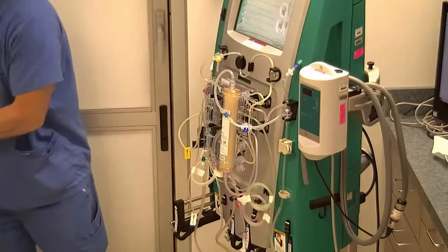And then from here, we're going to hit continue. So this is just saying verify setup. Make sure that you unclamp any clamped lines. Verify all connections are correct and secure. And we're going to hit, you have a prime button and a prime plus test button. To save time, we're going to hit the prime plus test button.